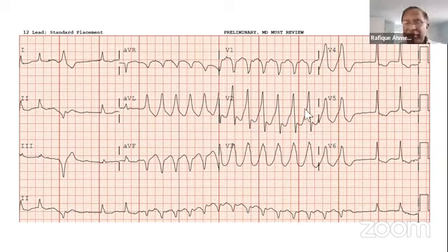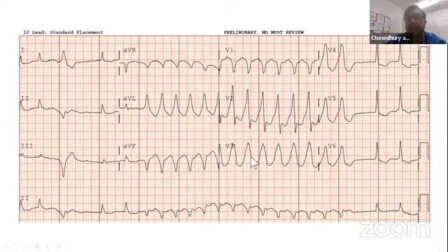Thank you. And the issue is that even if you call it metabolic or whatnot, it is tachycardia, right? Look at V3 in this EKG. It is wide complex tachycardia. So the question is, what is the probability of an underlying issue? Is it hyperkalemia? If you have suspicion, treat it, don't wait.